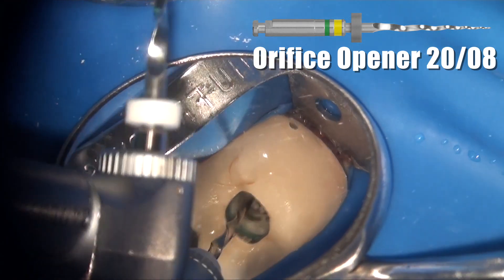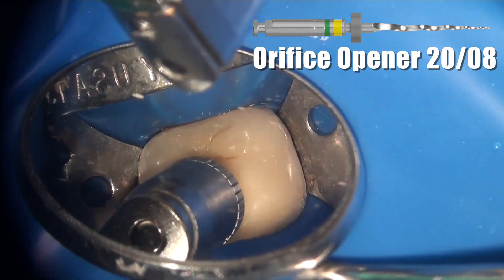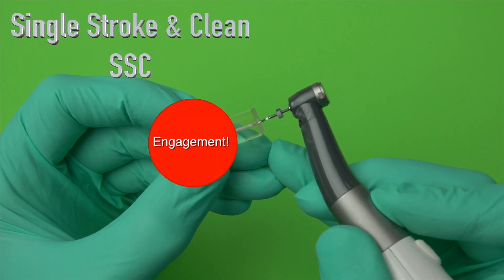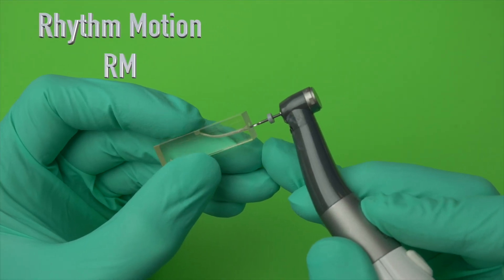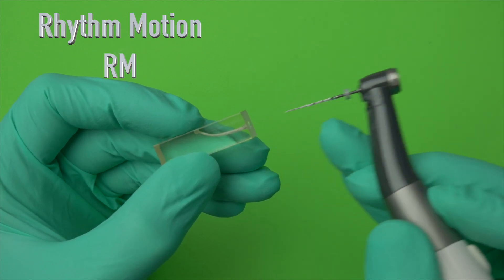Once the orifice was located, the ESX orifice opener was used to quickly widen the coronal orifice. The size 20 tip and 0.08 taper of the orifice opener helps increase the width very quickly and aids coronal access to the mid-root as well as to the apical third of the tooth. It's important to use short strokes to engagement — like SSC or single stroke and clean motion, or the rhythm motion of three strokes to engagement if you're using the endosync with the OTR motion. Try not to get too ambitious by pushing the orifice opener too hard trying to reach greater depth too quickly. Take what the canal gives you — take small bites with your files and let the instruments slide down the canal's natural path.